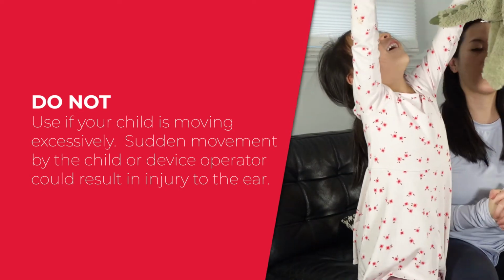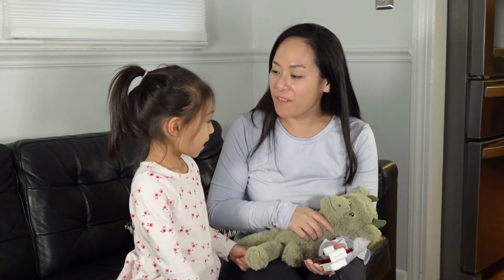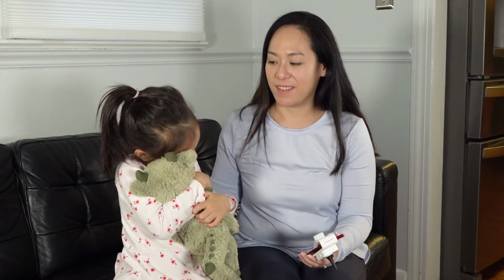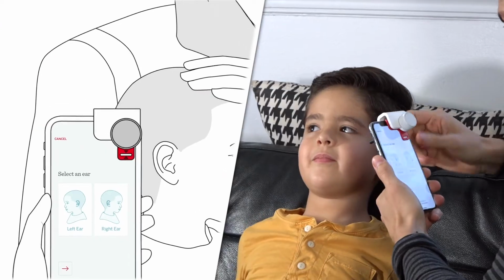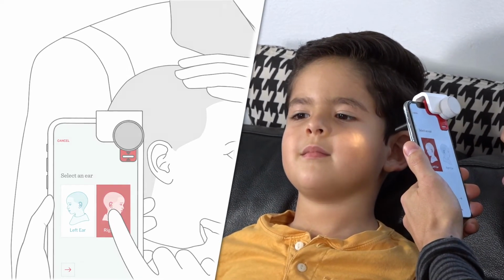Children sometimes have trouble sitting still, especially when they're not feeling well. A TV show, book, or a toy can be a great distraction to help keep them still while you're making a recording. To get started, push the button to turn on the light. Choose the ear that you'll be recording and confirm it in the app.